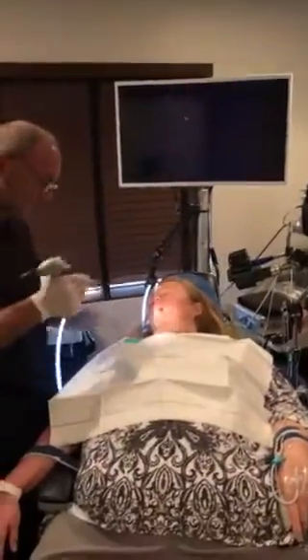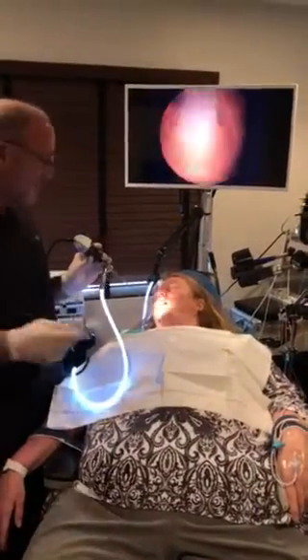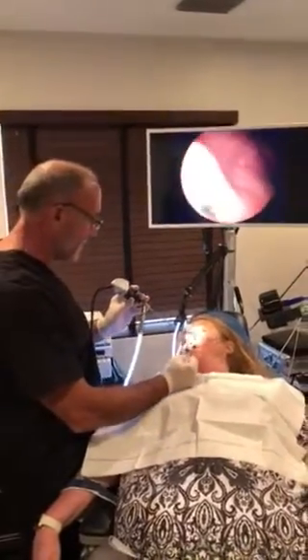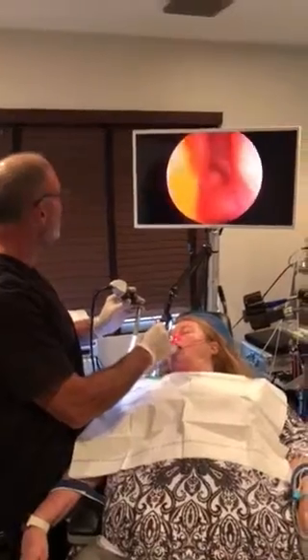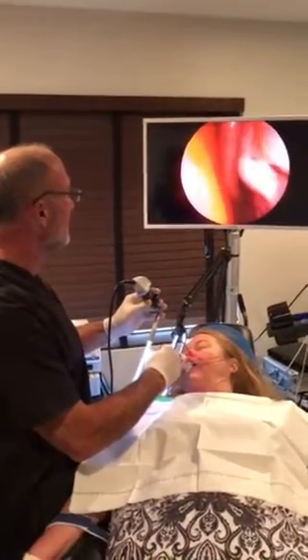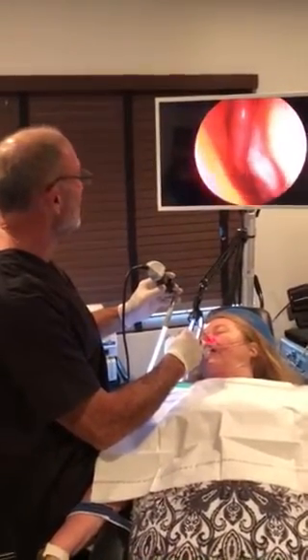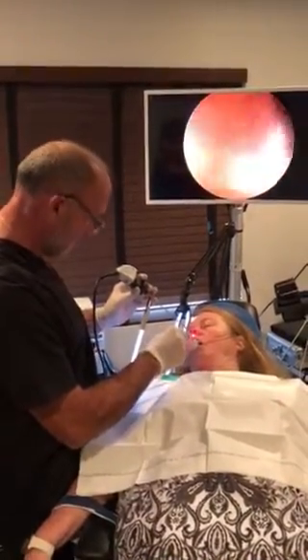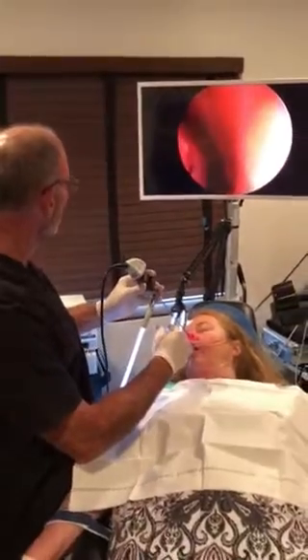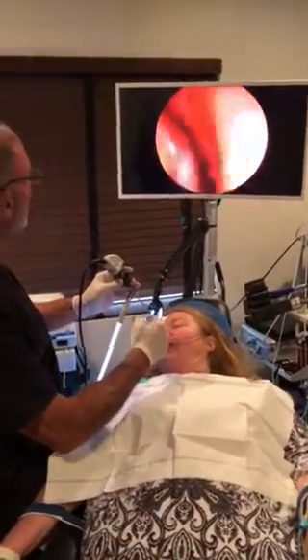And that completes the procedure — took about seven minutes. She's going to wake up with a very pleasant experience, no significant pain, and heal up relatively quickly. In a few days she'll be back to normal activity. I'm injecting her inferior turbinate with a little Kenalog, an anti-inflammatory steroid, which helps with healing and inflammation afterwards and the general reduction in the size of the inferior turbinates, which will help her breathe better in the long run.